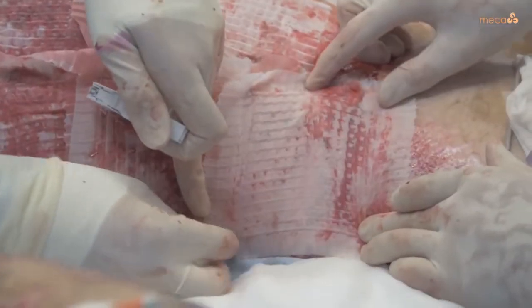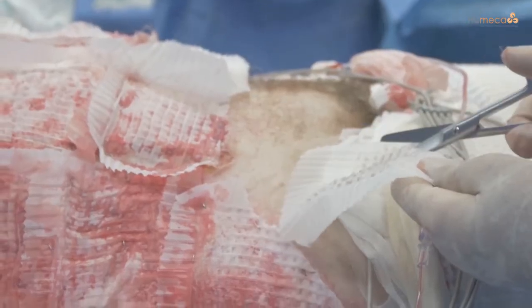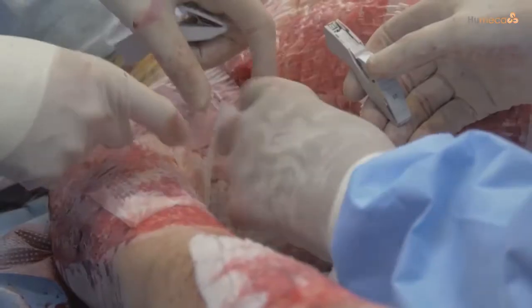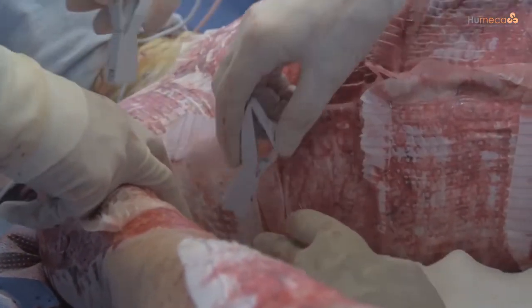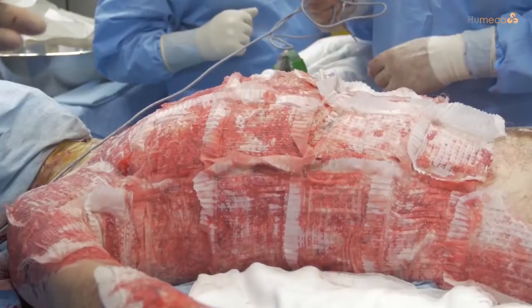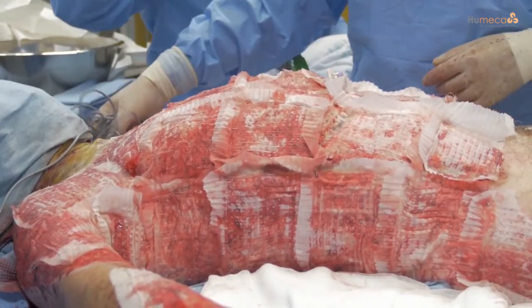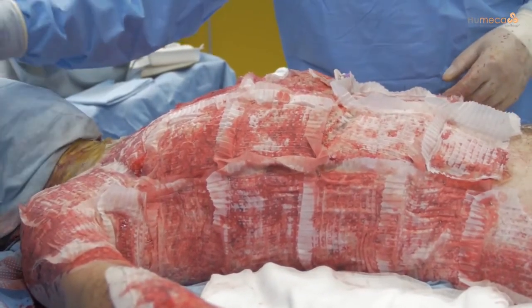The permeable nylon gauze acts as a carrier for the graft and helps protect from shear. Gauzes can also be trimmed to fit difficult areas. The graft islands adhere very well to the gauzes and handling is very easy, in contrast to the difficulty in handling widely expanded mesh grafts. All graft islands are correctly orientated to the wound bed in a regular pattern, and the distances between the islands are relatively small, showing fast epithelialization rates.